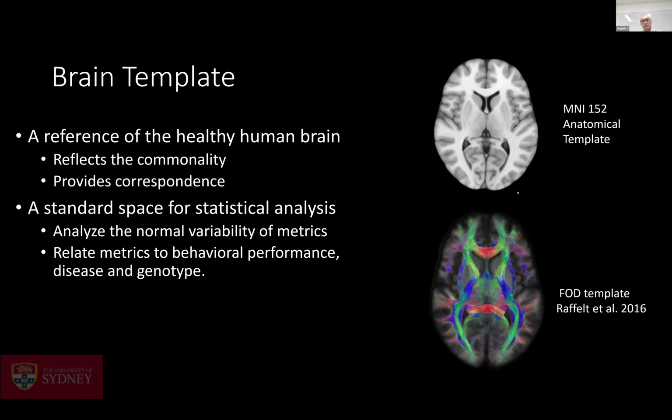If we register all the subjects to the template space, we can compare individuals. We can also compare groups. This helps us find imaging biomarkers for a certain disease.